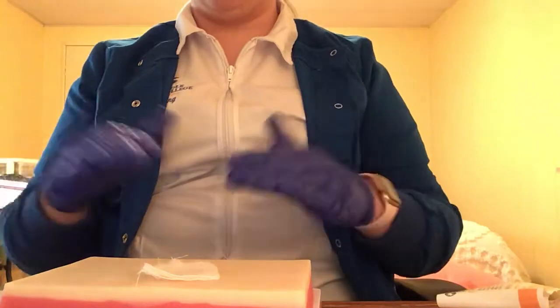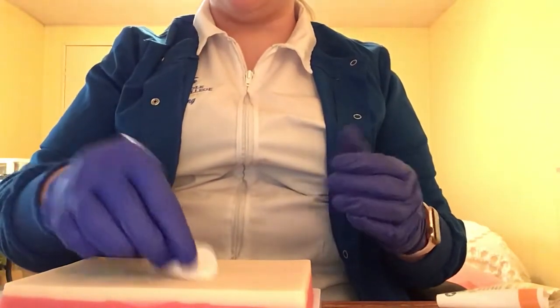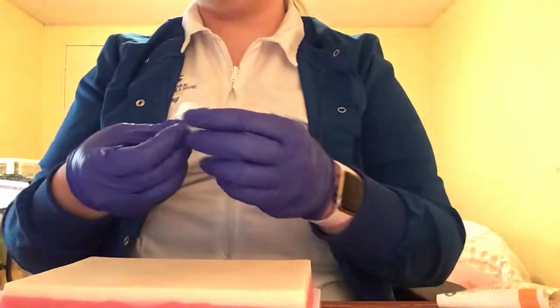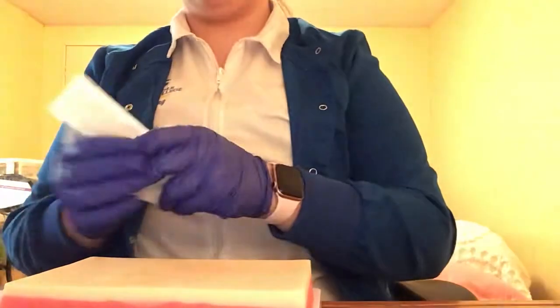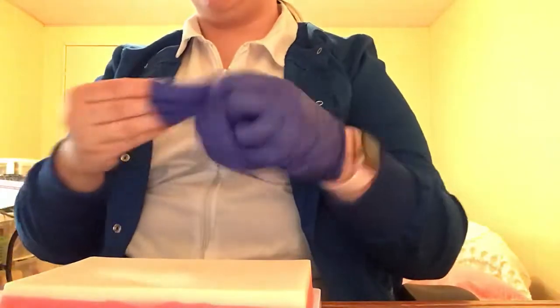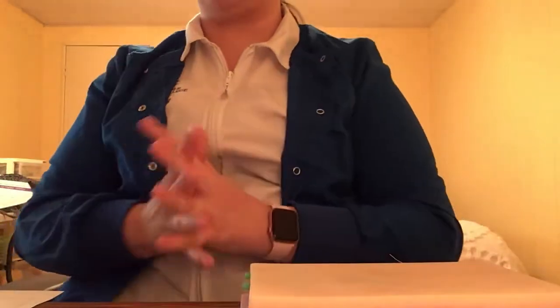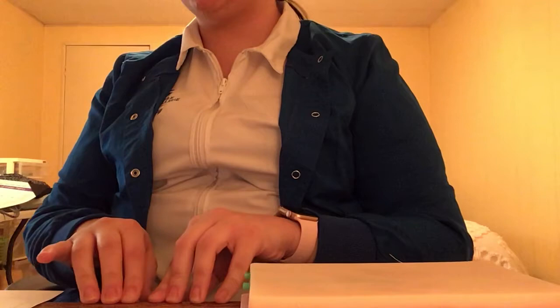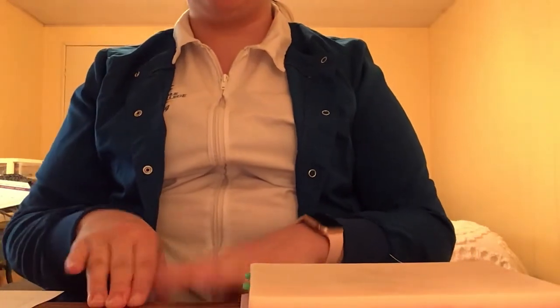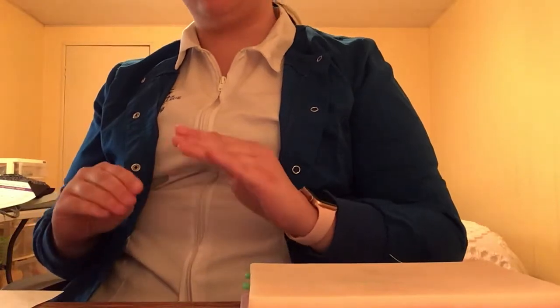So now that this injection has been completed, I would also apply pressure if there was any bleeding, and I would ask her if she was feeling okay, and I would apply a Band-Aid if need be. And now, since my sharps are in the sharps container and the lids are on, I would remove all of my garbage and remove my gloves. I would ask her if she's feeling okay, and I would stay with Anna for a little bit while I did my charting, and I documented that I gave both of these medications, and I would make sure that she doesn't have any of those adverse allergic reactions to the influenza vaccine.